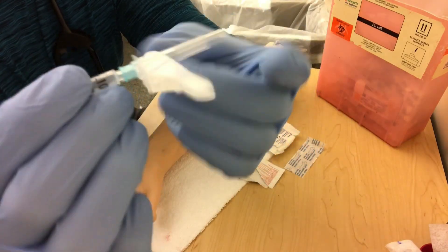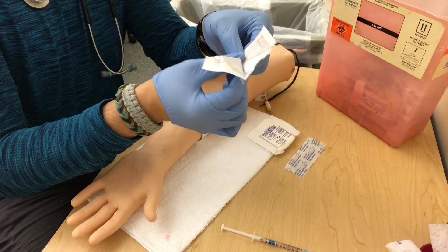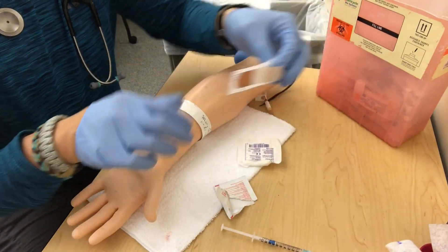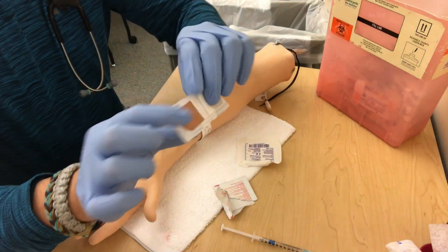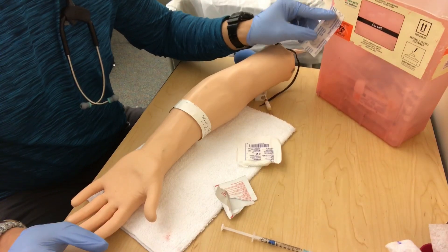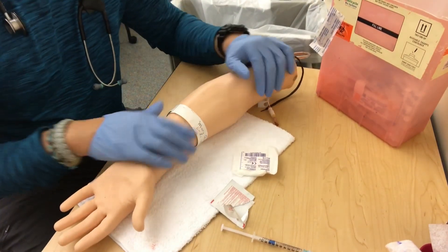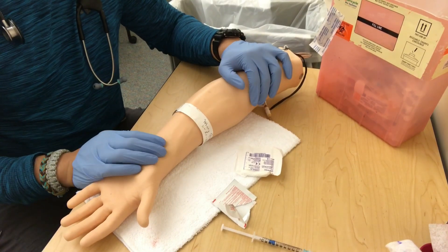I have my alcohol pre-opened and my gauze pre-opened, put this next to the patient, and I have my band-aid with half of it already taken off, ready to grab one-handed after I stick the patient. I was unable to find a human volunteer, so Mr. Arm is going to have to do.